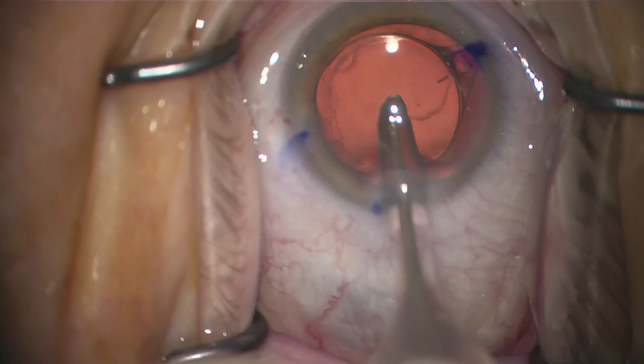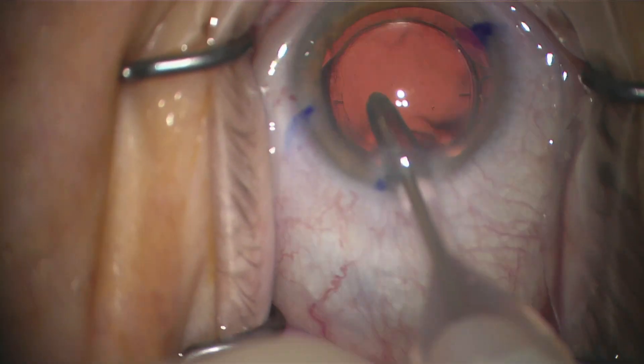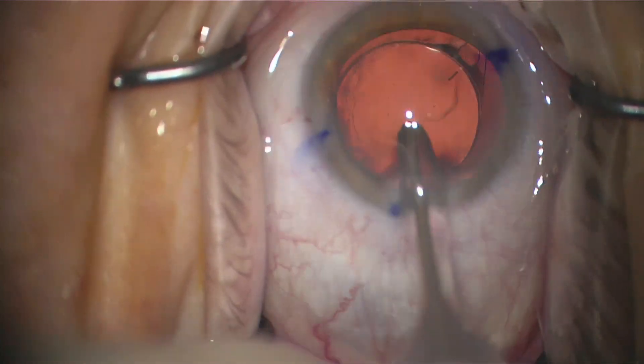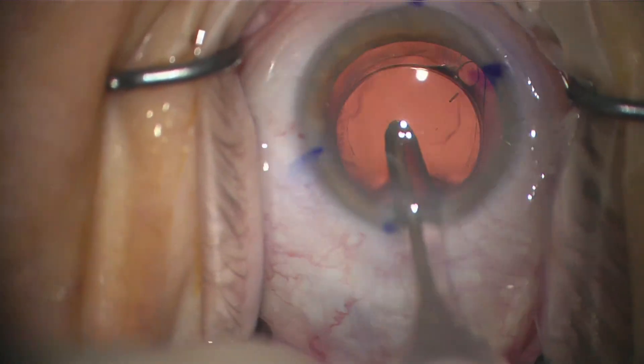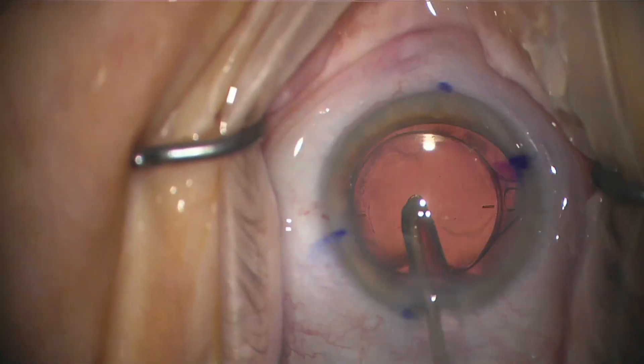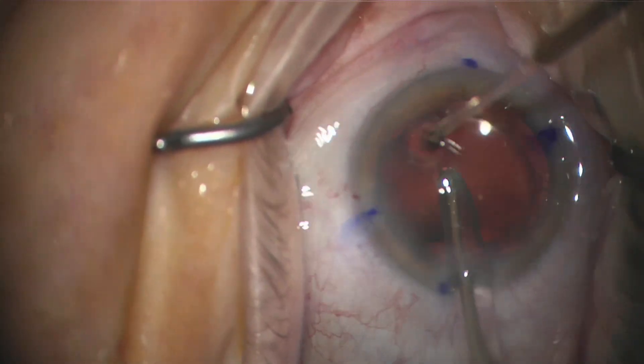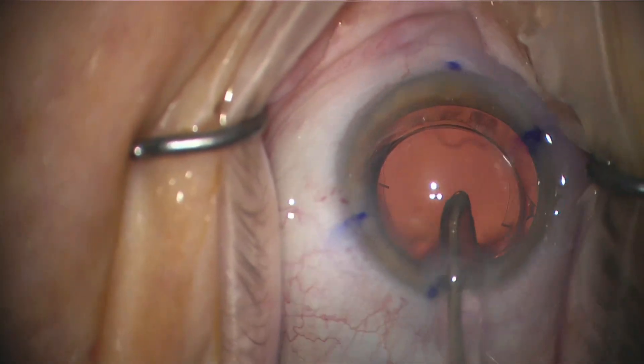Here what I'm doing is rotating the lens with the irrigation aspiration tip, and I'm doing so with little movements, suctioning down on the lens and rotating. I'm making little movements either clockwise or counterclockwise. The way it works is if I move my tip clockwise to the right, the lens moves counterclockwise to the left.